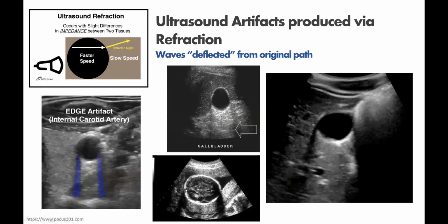So this is a skull of a fetus, which also can cause refraction. Okay.